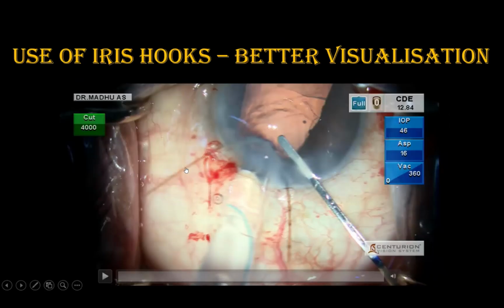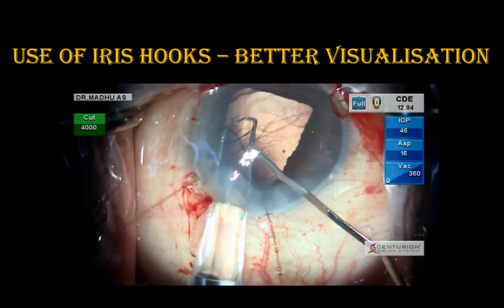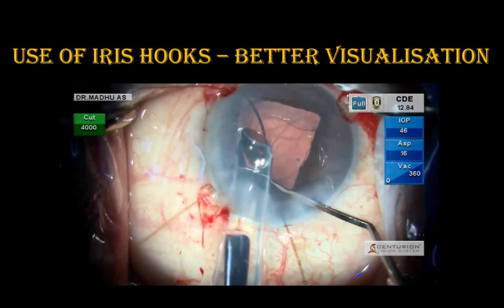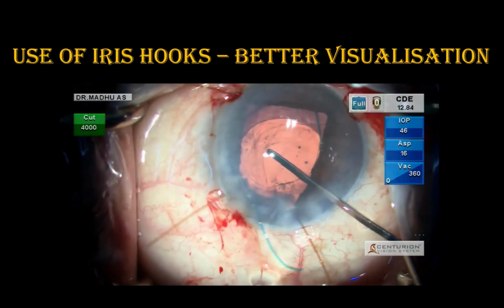And always make sure that, either with the help of Kuglen's hook or Iris hooks, you can visualize your sulcus support in a much better way. Like in this case, I have used Iris hooks to see the good sulcus support. In this case, PCR with rhexis extension was there.